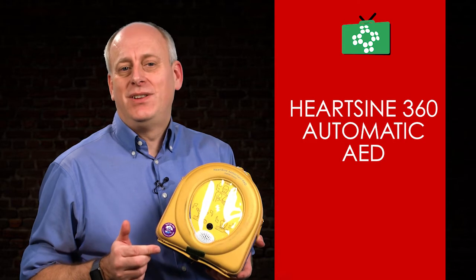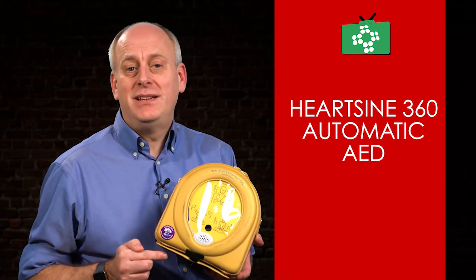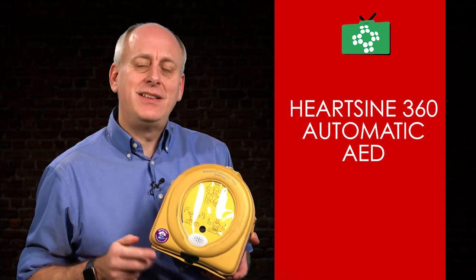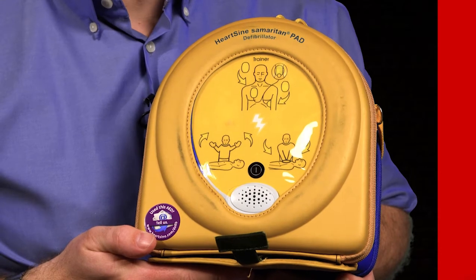Welcome to this edition of the First Aid Show. The Samaritan Pad 360p is a fully automatic defibrillator designed to analyse the heart rhythm and, if needed, automatically deliver a life-saving electric shock.